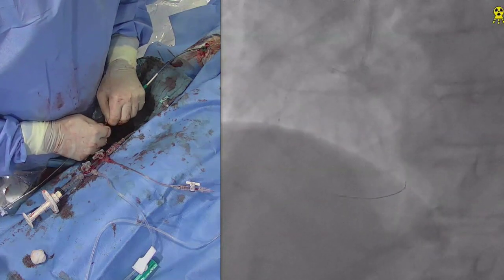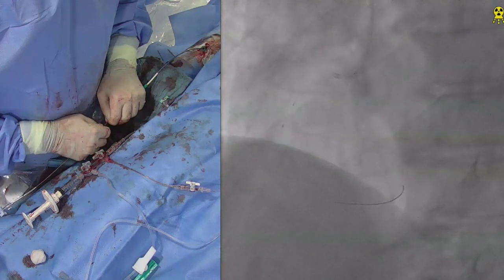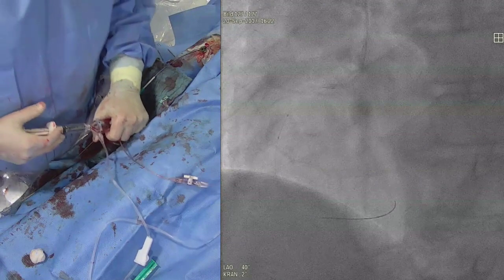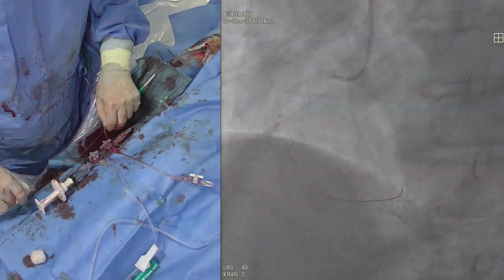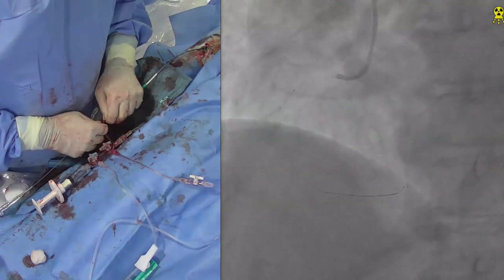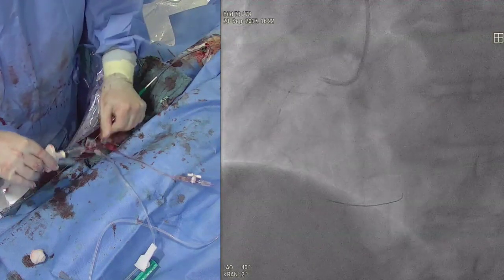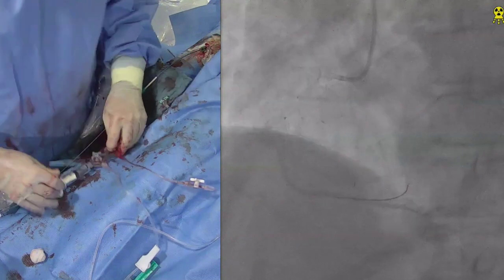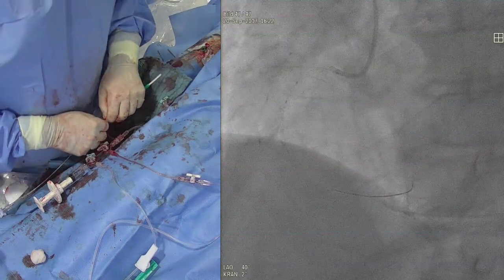Do you use cutting balloons or AngioSculpt balloons here in Europe or Germany? Because that's also a nice way. If you go with an AngioSculpt balloon, you know that the stent is going to go through, because that's such a stiff and high crossing profile device. And it's nice just to prepare the vessel for nice stenting. But it's not heavily calcified, so I think the best indication for scoring balloons or cutting balloons is heavily calcified vessels.